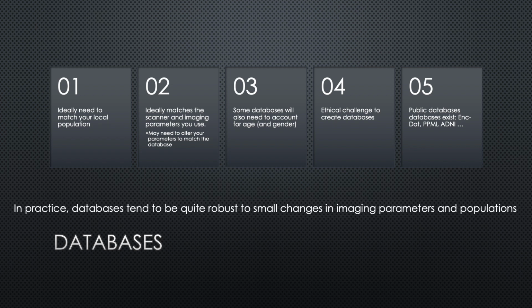So I've mentioned that ideally you need to match your database to your parameters and to your local population. But actually in practice, anecdotally, the databases do tend to be quite robust to small changes in image parameters and populations. So you'll find they work relatively well with the scanners and populations that you have locally.